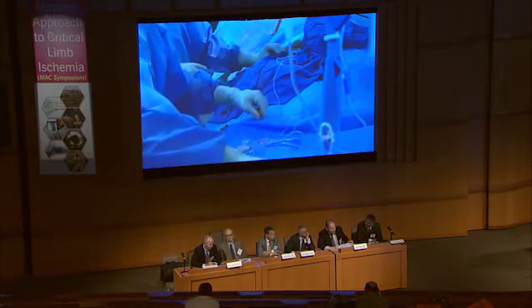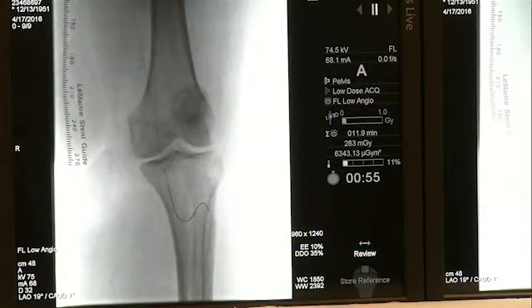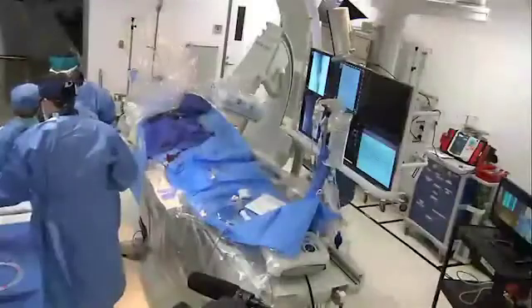I was just going to ask whether or not you were considering doing a selective shot of the profunda to see whether in fact. I don't think that's a bad idea. We can actually do that. Give me that Navicross. Let's do that. I think Dr. Farber has a good idea, and Dr. Manzi has another suggestion.